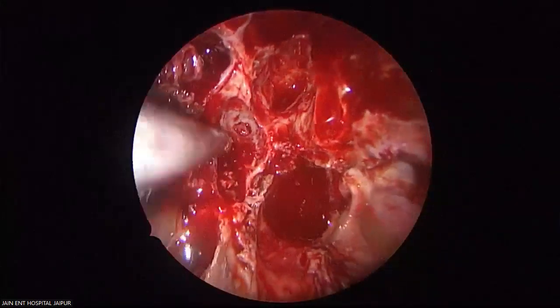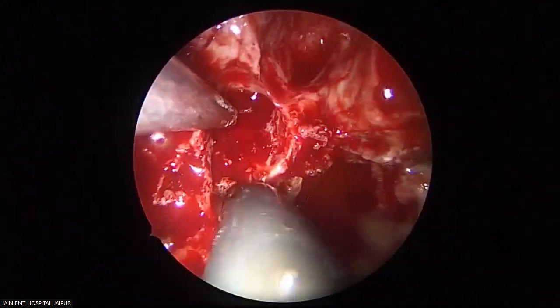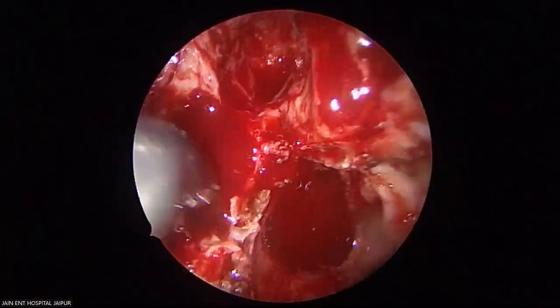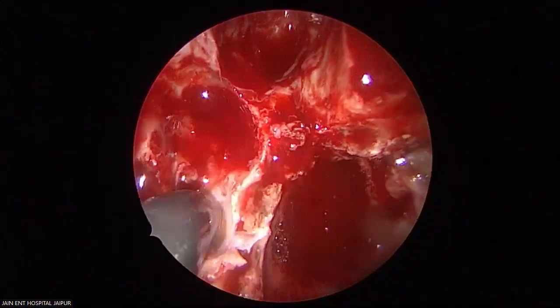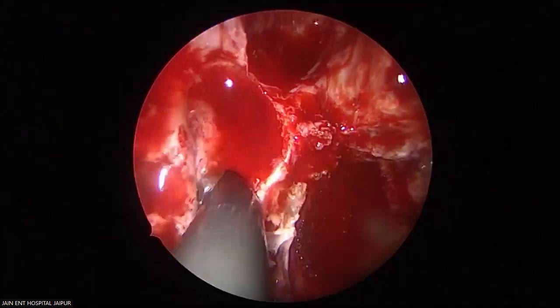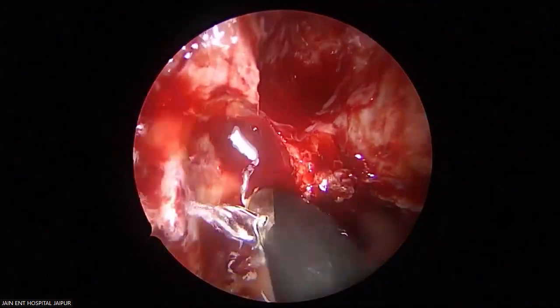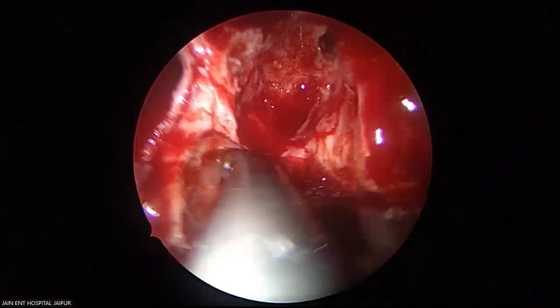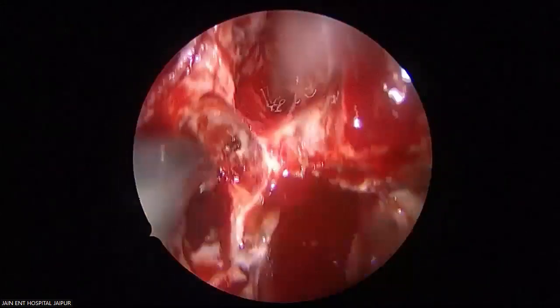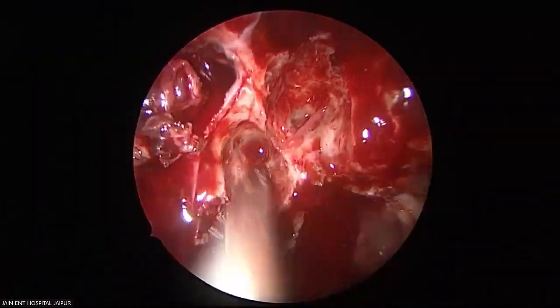Now first of all, from below, see that these are the pterygoid muscles. And what you see is this venous bleeding from the pterygoid plexus. Can you see here? That is easily controlled with Surgicel. Give me a small piece of Surgicel.